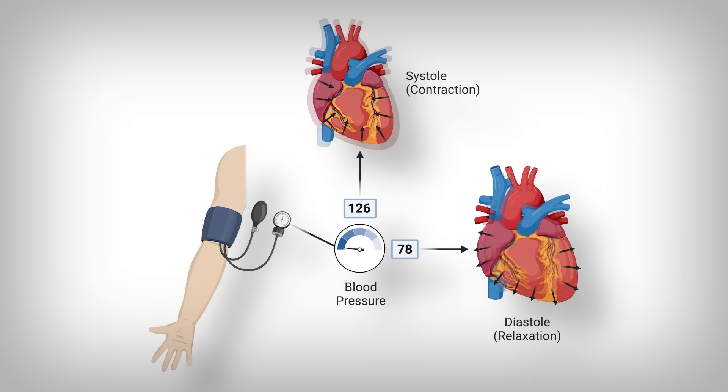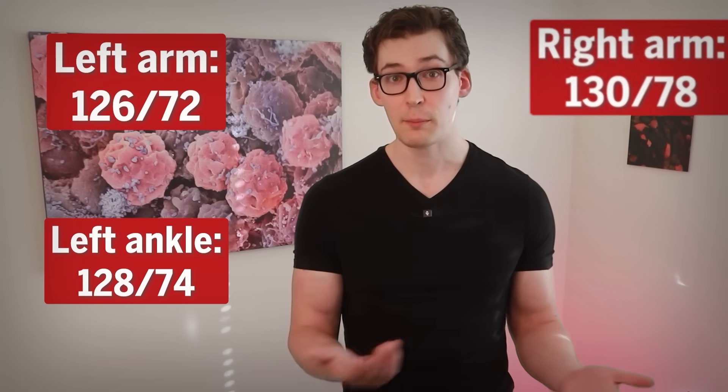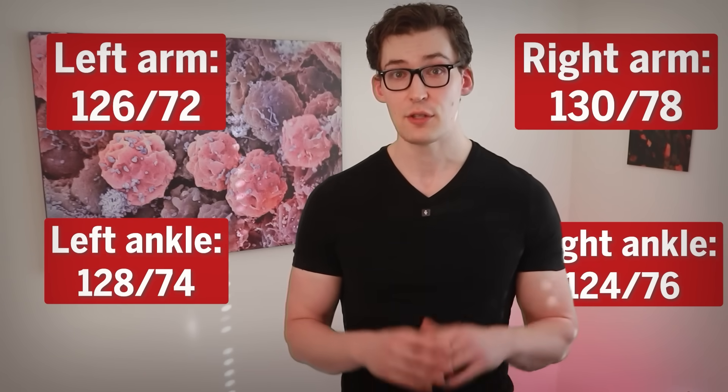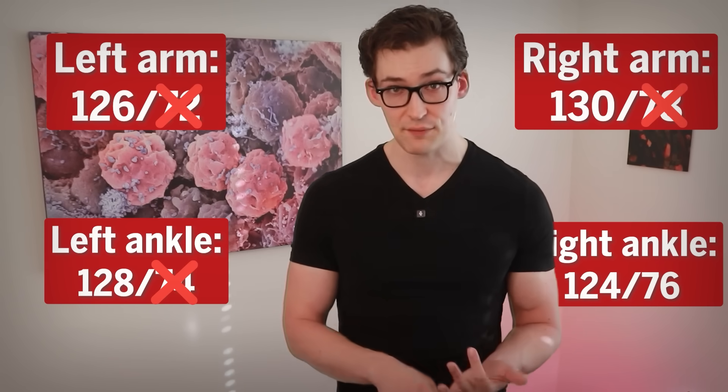Those are the raw numbers. You have a top number and a bottom number, corresponding to the pressure applied to your cardiovascular system. The top number is the systolic blood pressure — the pressure exerted when your heart muscle is contracting. The bottom number is your diastolic blood pressure, or the pressure at its lowest point when the heart muscle is relaxed. You'll have eight total numbers corresponding to four limbs. Just ignore the diastolic numbers. For example, if readings are 126 over 72, 128 over 74, 130 over 78, and 124 over 76 — just cross out the 72, 74, 78, and 76. They don't matter for this test.